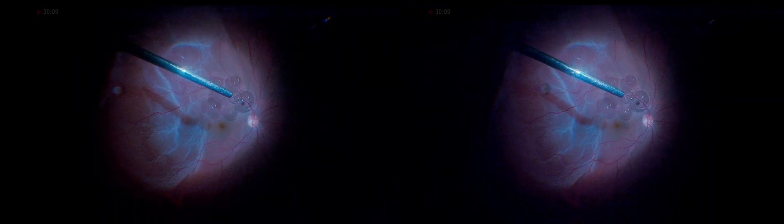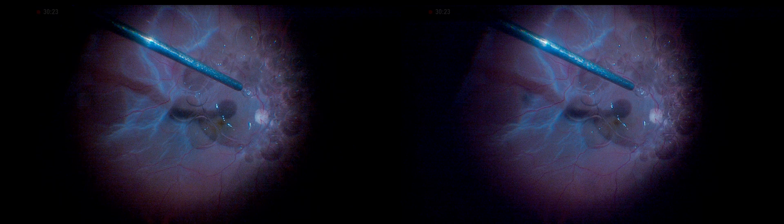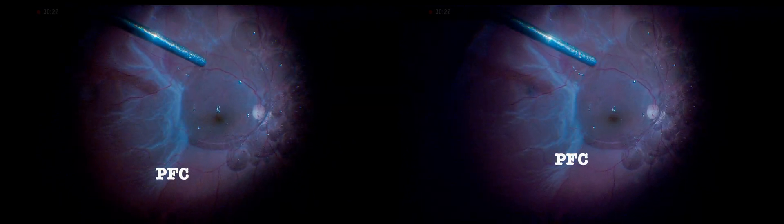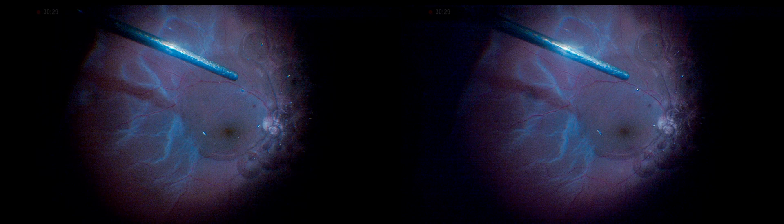The next step involves slowly injecting perfluorocarbon liquid until it passes towards the very retinal periphery, covering the now-flattened retinotomy.